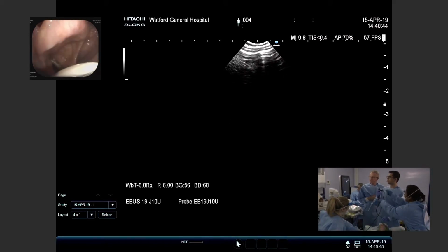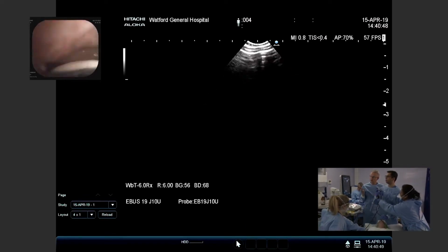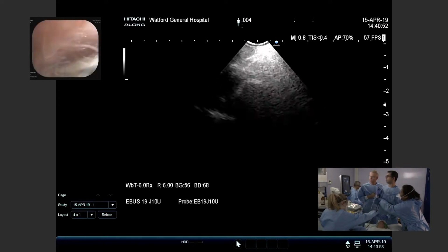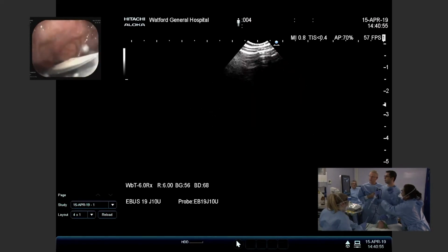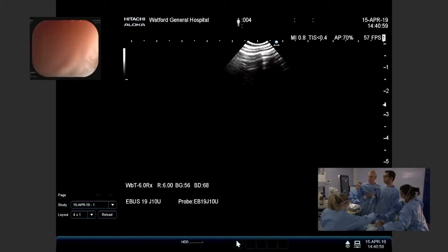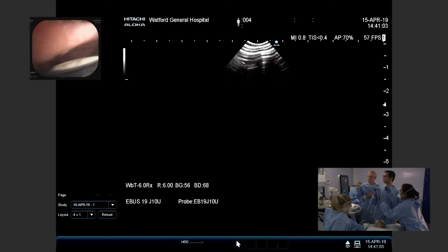So this is a technique whereby you're administering topical local anaesthetic straight onto the vocal cords, not the transcricoidal. And I guess for anyone, naturally, you would expect them to cough. Indeed. Okay, another one, please. Just 2% is fine.